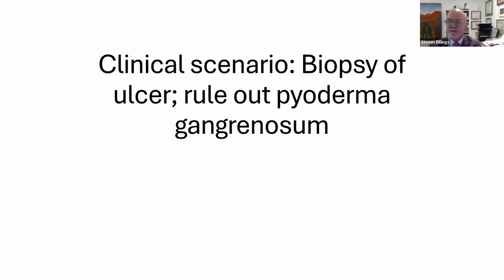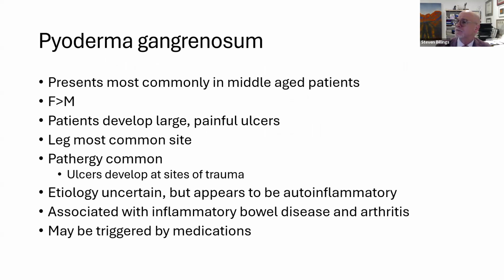Other inflammatory conditions. This is a very common clinical scenario in my practice: the patient will be hospitalized, they get a biopsy of an ulcer, and the clinician is worried about the diagnosis of pyoderma gangrenosum. I used to find this very frustrating. It's not actually that frustrating because we can only do so much as a pathologist to make that diagnosis. So let's talk about pyoderma gangrenosum in a little more detail.